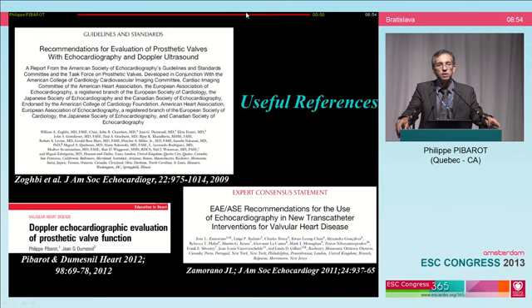I agree, and sometimes you have your answer with echo. I mean, sometimes with the TTE you see the dysfunction, but with TTE and TEE, you may have some false negatives, especially when the dysfunction is symmetric, when it affects both leaflets, sometimes it's difficult to catch by eye by TEE, and you may use cinefluoroscopy or CT.